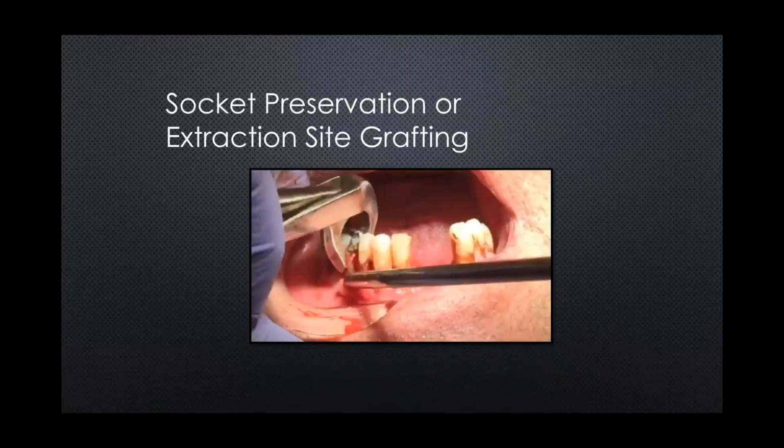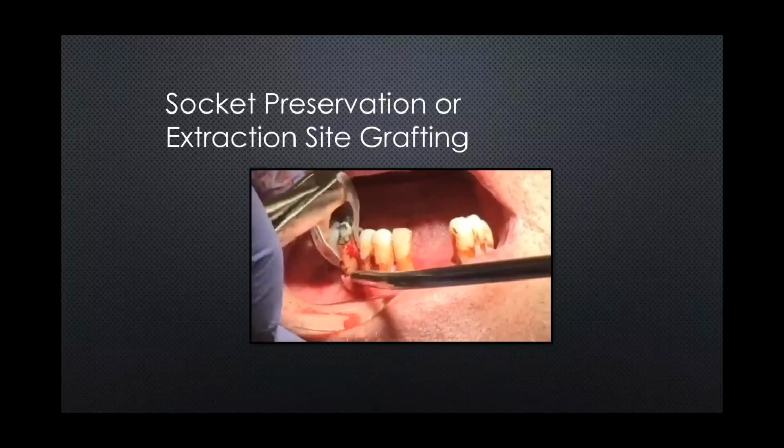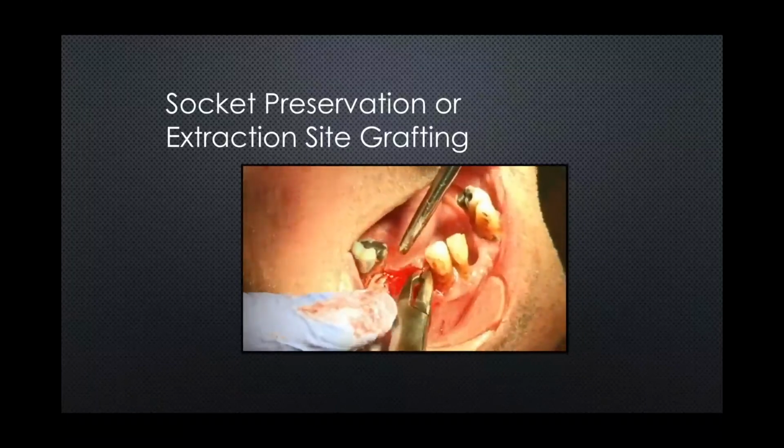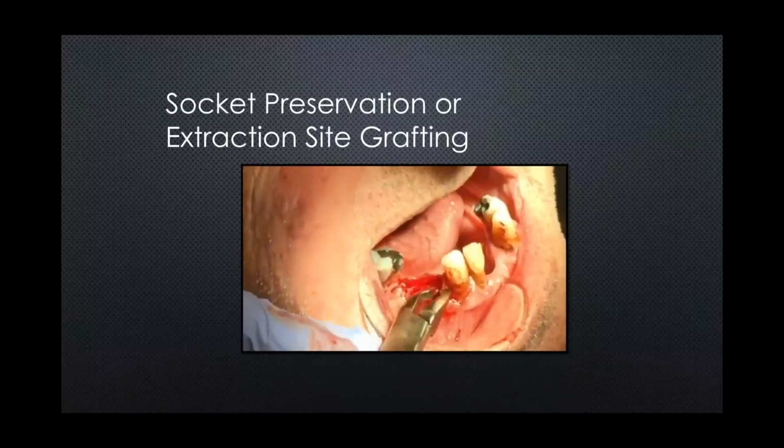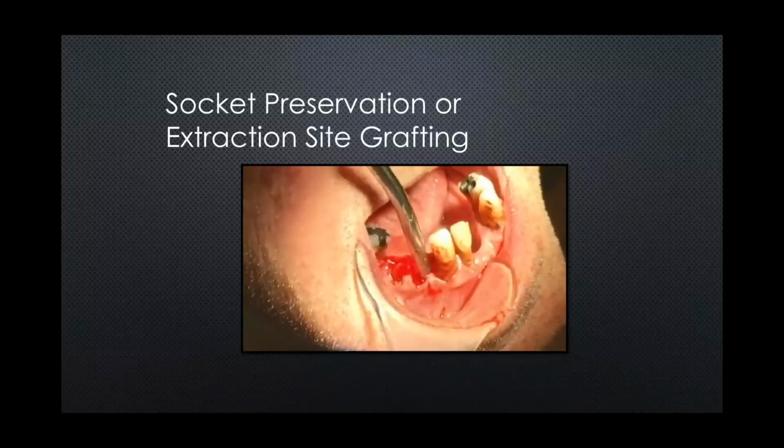But once again, here's our ash forceps. We seat our lingual tissue to our buccal, and it's just a rocking mesial distal figure 8 motion. We take it out. Okay, remove any disease or granulation tissues that we have, free any type of necrotic tissue, purplish tissue, anything that just doesn't look healthy, we remove that.